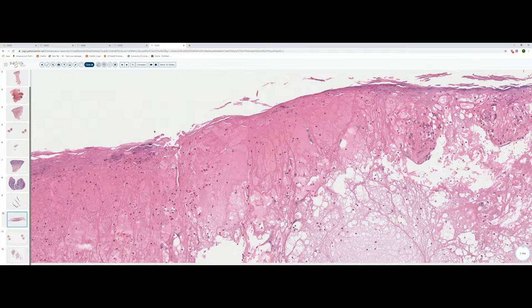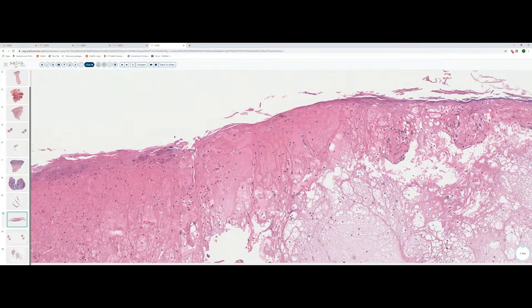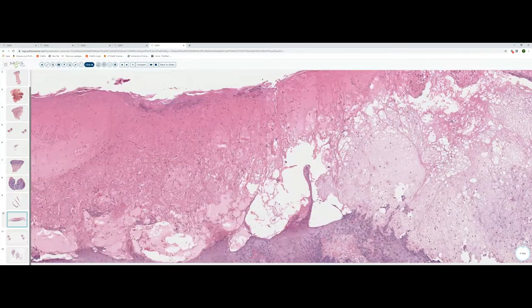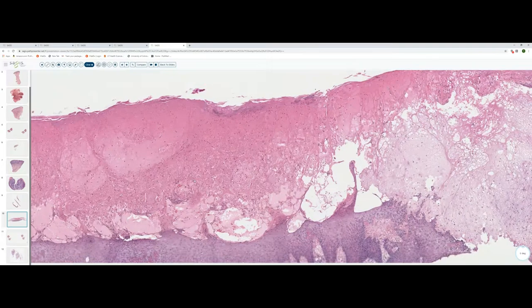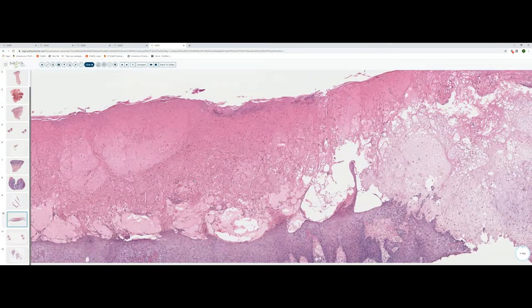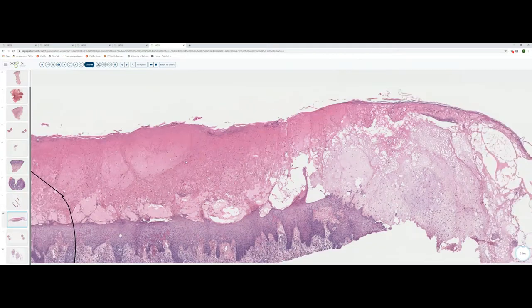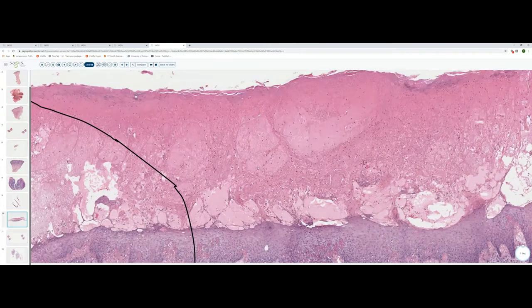And while there may be some spongiosis here, I think it's pretty obvious that this blister has mainly formed as the consequence of ballooning. These keratinocytes have accumulated so much intracellular edema that they just exploded. The nuclei are gone. These cells are necrotic. And we're getting a coalescence of cell membranes to form this reticular network. This is reticular alteration. And when you see extensive ballooning like this, two broad categories that you want to think of are nutritional deficiency disorders. I've never seen this much ballooning in a nutritional deficiency disorder.